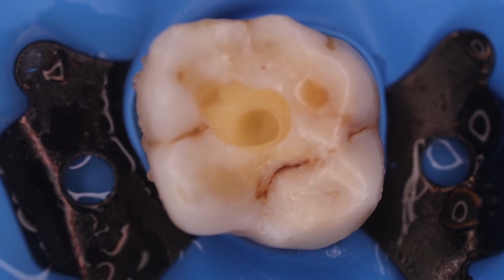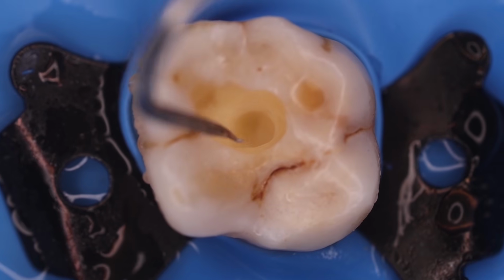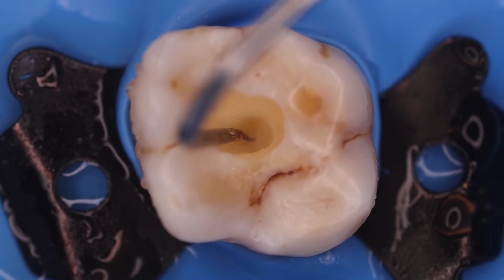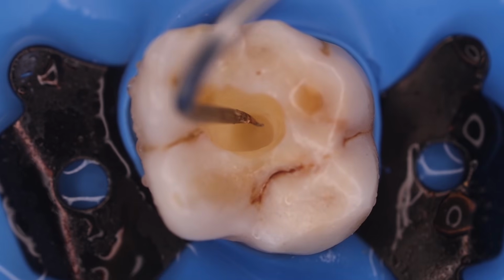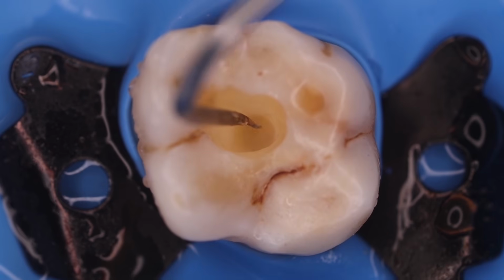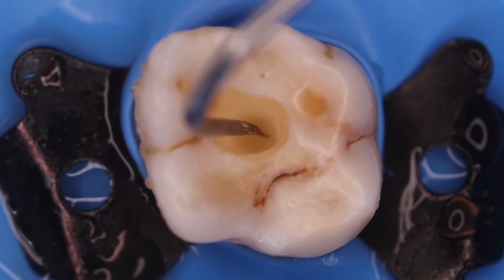Now you can see that we have expanded the access cavity along the mesiobuccal cusp, following the external outline of the tooth, and we have also achieved depth with the help of this round burr. We will again go into the depth to get the burr drop, and then change to the next burr, an Endo-Z burr, so that we can be safer inside the pulp chamber. So let us proceed with the round burr itself until we achieve the burr drop.